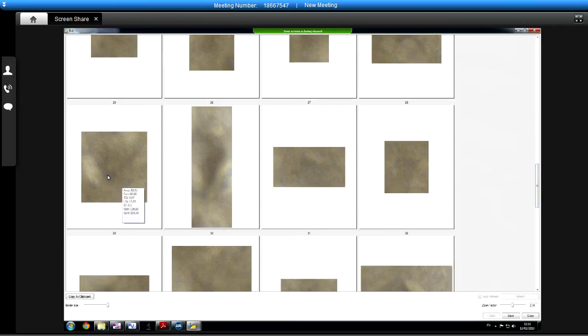Yeah, I suppose that brown there matches the brown we've. These are heavily zoomed up, obviously.